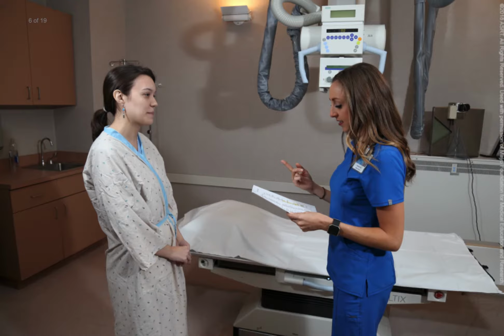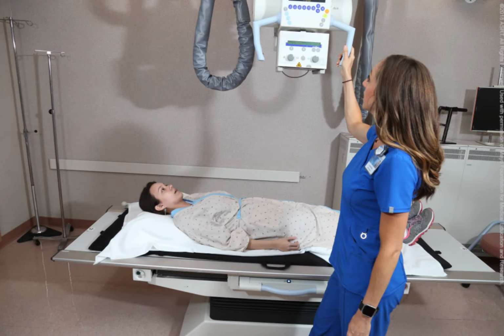Patient history includes a discussion of any known anatomical variants that may affect the exam, as well as any medical devices implanted in the area of interest. For example, technical factors will need to be adjusted if a patient has a joint replacement or severe arthritis. Patients must remove clothing and jewelry in the area of interest and be provided with a gown for privacy and to prevent the patient from getting cold.